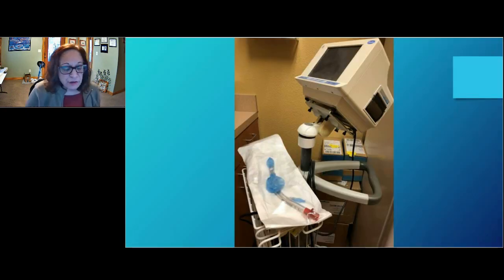Just a quick reminder, when we talk about the principles of storing sterile items, it applies to all sterile items, not just what you have sterilized in your facility. This is a great example from an oral surgery practice I went to. I happened to peek into this storage room, and in there were the monitors the anesthesia would use, and an endotracheal tube stuffed in this.